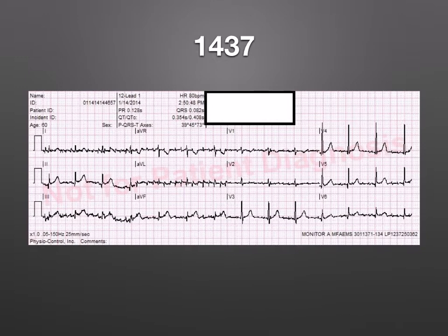One of the reasons for that is that it is not uncommon to have depressed PR segments, particularly in pericarditis. That's the reason pericarditis is an imposter. It looks like you have diffuse elevations in non-anatomically contiguous leads all over the place. And you do have some ST segment elevation even when measured correctly. But what you really have that's really noticeable is that elevation in relation to the PR segment. And that's the reason that we measure it in relation to the TP segment, not the PR segment.